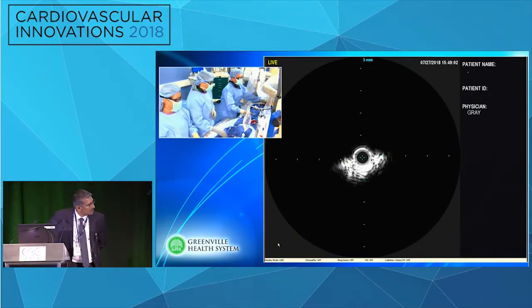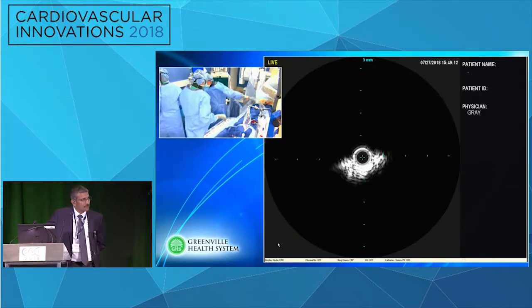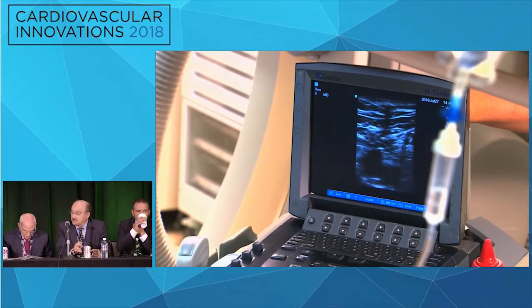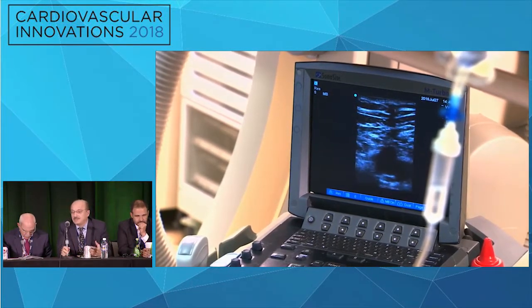Mehdi, you would use some ultrasound on the skin here, or is it not helpful? I think to get the access is maybe helpful because it would maybe tell you if you're in the more common femoral vein, and you did it already, but above that, I don't think it's going to be useful. So why not go from the femoral vein? And we do that a lot, really, even in the middle of the thigh or a little bit higher near the adductor canal, because it's very superficial, and you can have very good purchase there, and it helps a lot.